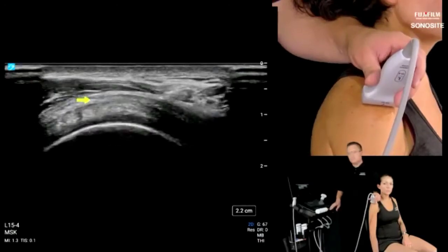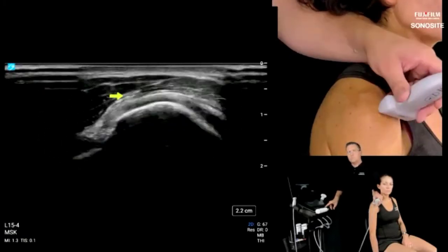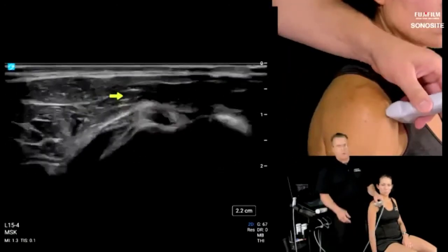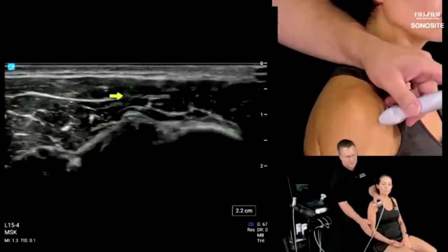Great, and we actually have a few more questions coming in. You just mentioned the subcoracoid bursa. Can you highlight that on a scan as well? Sure, I'll do my best because they're best seen when they're abnormal. Right. So we're here on the front part of the shoulder. I'm going to go back to the biceps tendon that we normally would do, right?